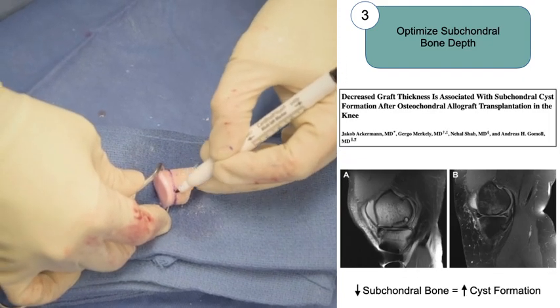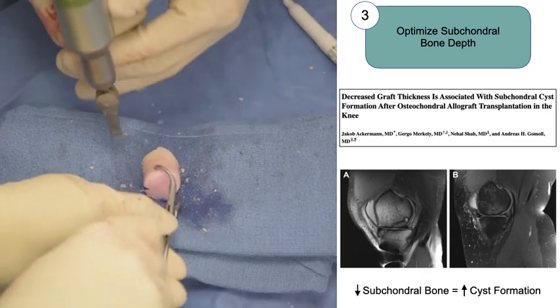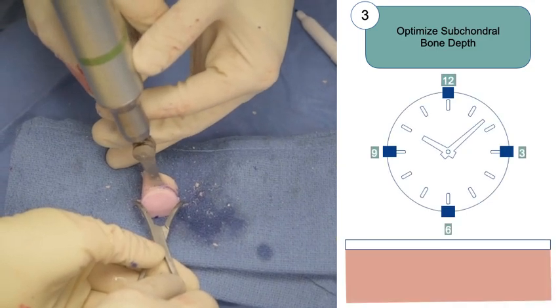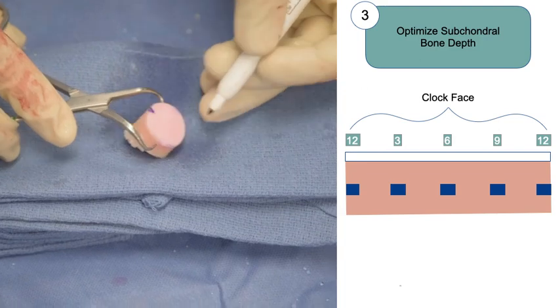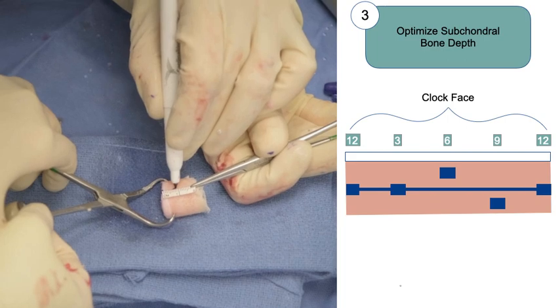However, bone depth less than 4 to 5 millimeters may also be associated with increased cyst formation, so the bone should not be too shallow. We take care to aim for this depth throughout the graft at each of the 12, 3, 6, and 9 o'clock positions. While in some locations such as the femoral condyles you may have a uniform graft depth, depth may vary greater in the more contoured locations of the trochlea and patella.